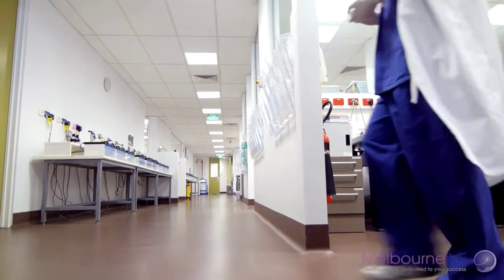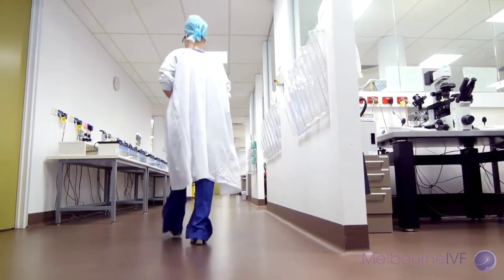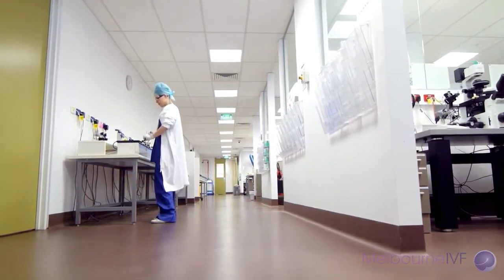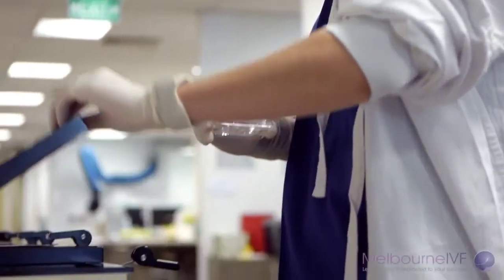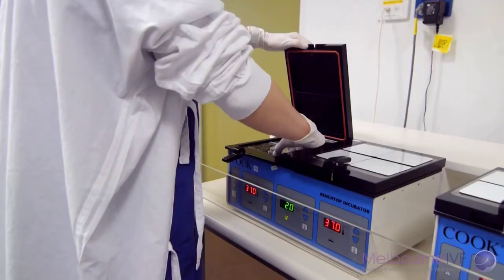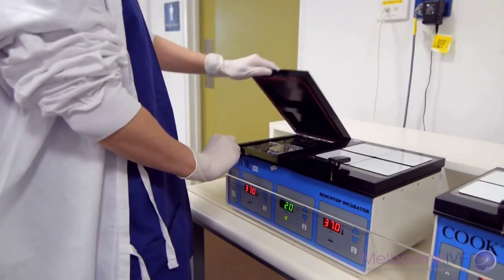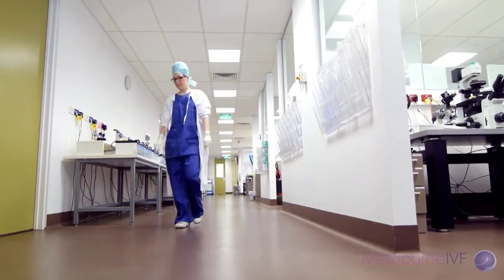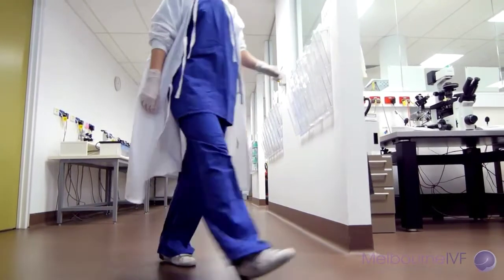The incubation of embryos occurs by placing them in special growth fluids called media, referred to as culturing. The embryos are then incubated and monitored for 2 to 6 days. The fertilization takes place in incubators at 37 degrees, where the atmosphere, humidity, and temperature are carefully monitored and controlled.